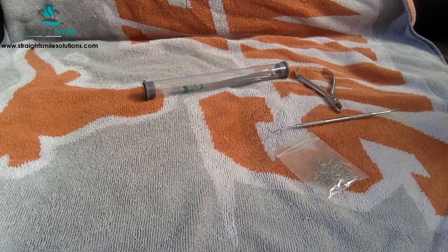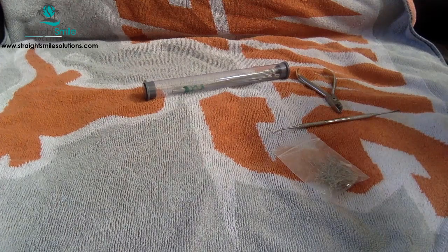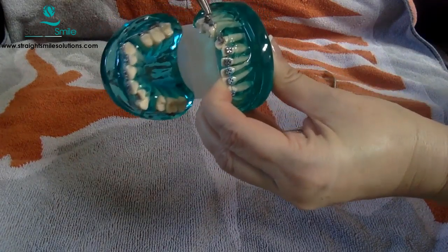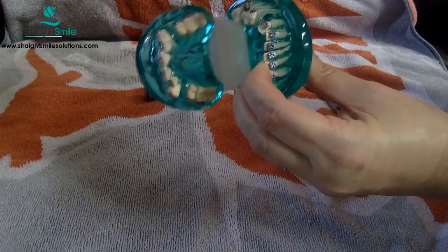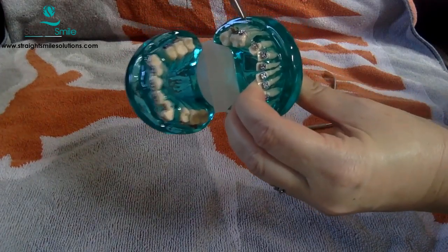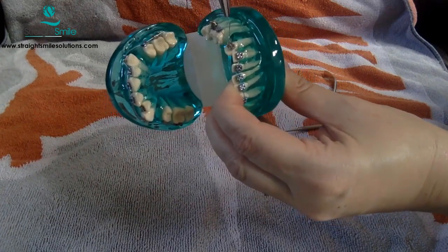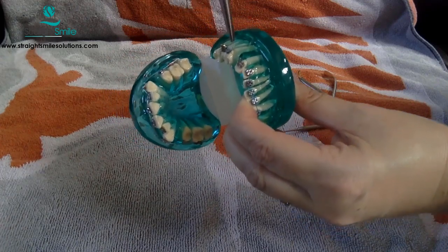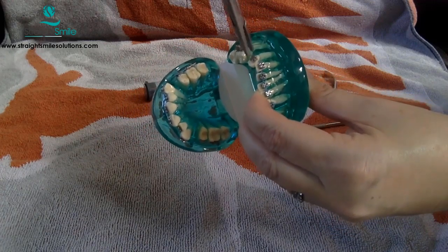Once you get around all four wings, you're going to start twisting it. Okay, am I around all four wings now? Yes, I am. So now I'm going to start twisting it, and make sure you're pulling it nice and tight. There shouldn't be any flash at the end. Keep twisting it until you start to see the wire double back on itself, which is what's happening right now. See, it's starting to become like a pigtail. If you twist it too much, it's just going to break.